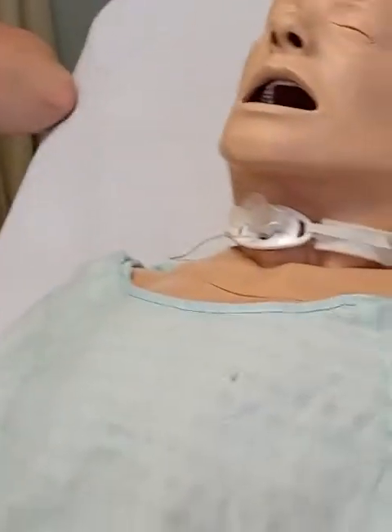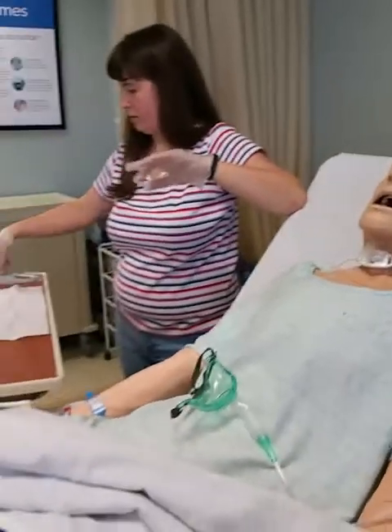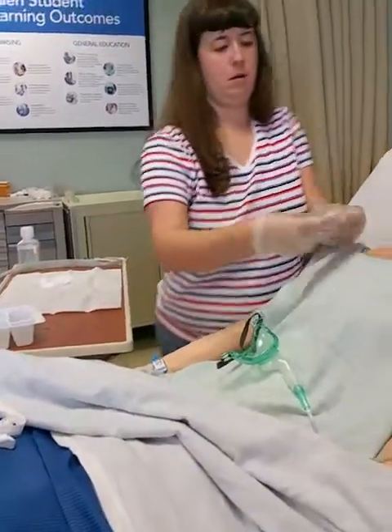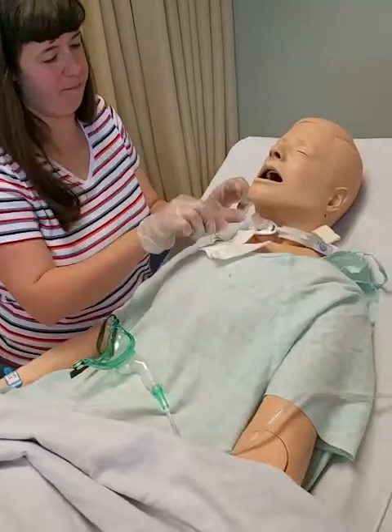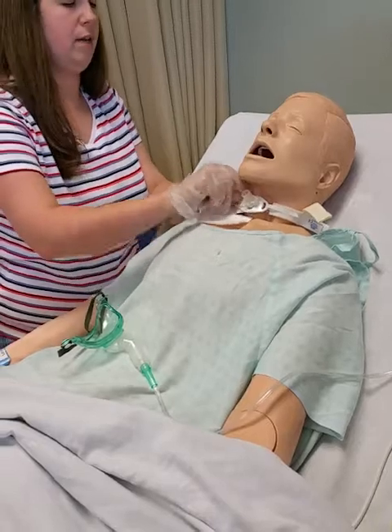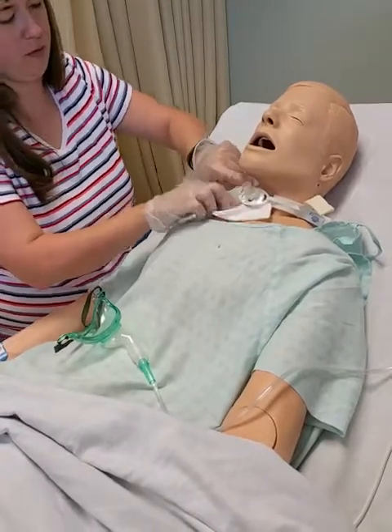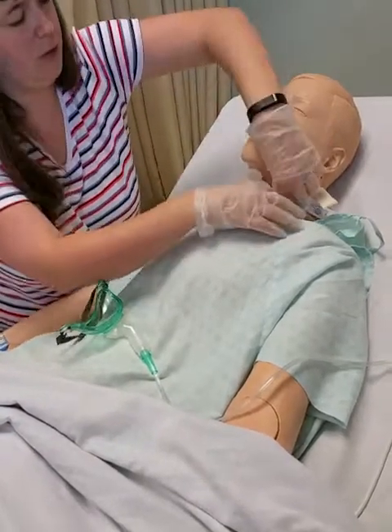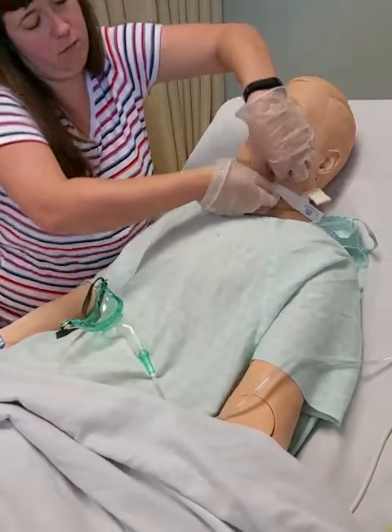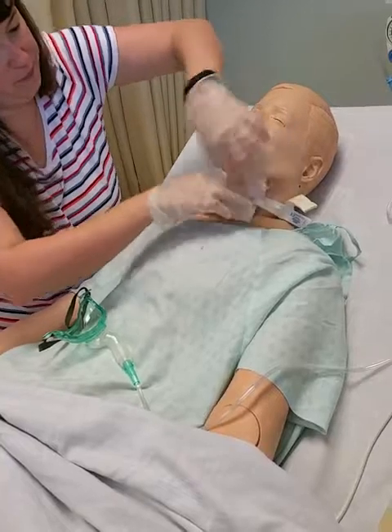This would go in the garbage, but keep them for practice. Okay, now V goes up to catch all the secretions. You want to try and get this all nice and smoothed out because you don't want it to cause any skin breakdown. You're probably going to change this a little more frequently than you're doing full trach care. Okay?